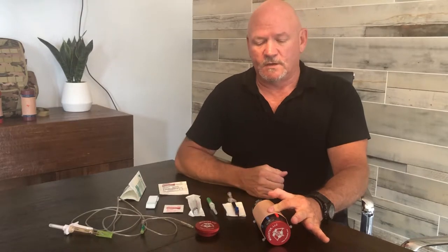The next thing you're going to do is fill your syringe with your simulated blood or the fluid that you're going to be using. We're going to be using the C method just like before, where your index finger is actually going to be pressing down hard on the vein. That's going to occlude the blood flow coming through. You're going to use your thumb as a guide, and it's actually going to hold that vein in place so it doesn't roll on you.